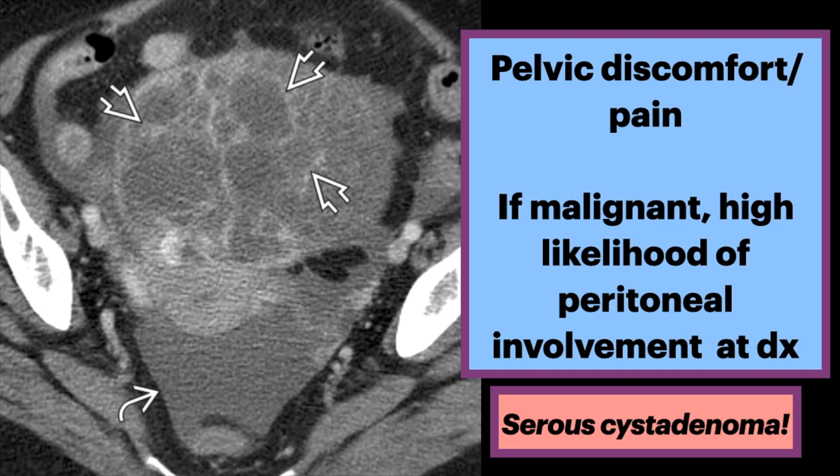Be sure to pay attention to any complications. On this axial CT, there are multiple septations and pelvic free fluid. Pathology showed serous cyst adenoma with necrosis due to torsion.